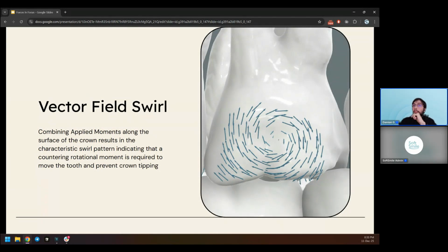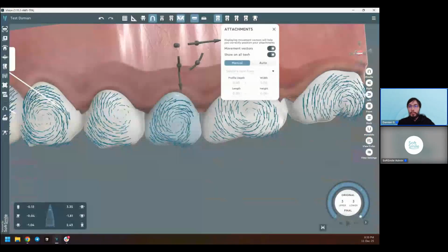Actually, I wouldn't be able to tell you this conclusively. I can only tell you what the math says. And in the case of this particular situation, the reason why we've introduced this feature is so that you can look at it case by case. And it appears that for this case, placing it perpendicular to, so we could also place an attachment here and here, as long as the attachment is perpendicular to the arrows and it's in the place which is populated with the longer arrows, it's going to be most effective. That's what physics says.